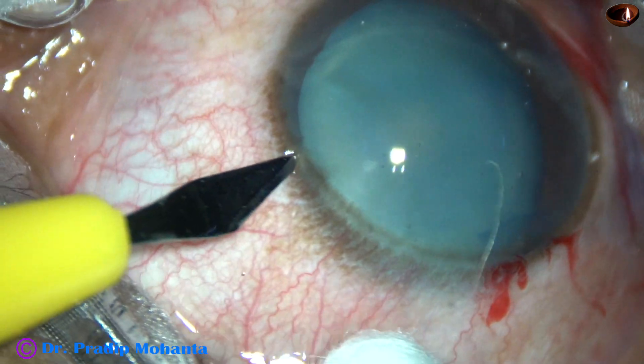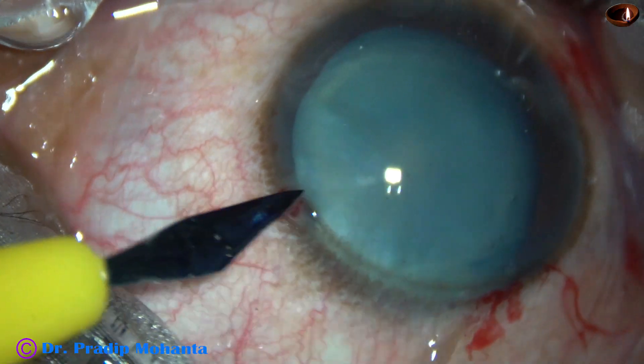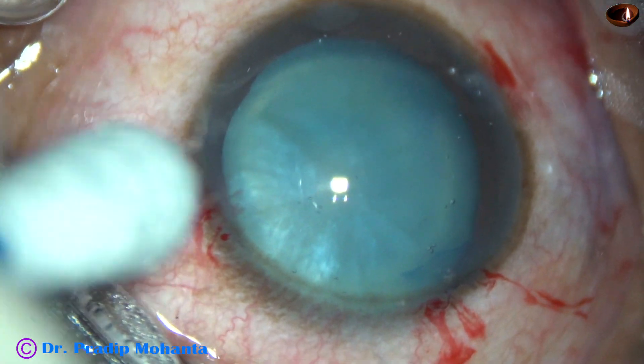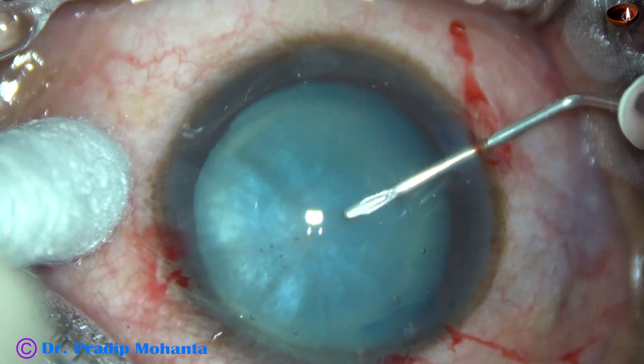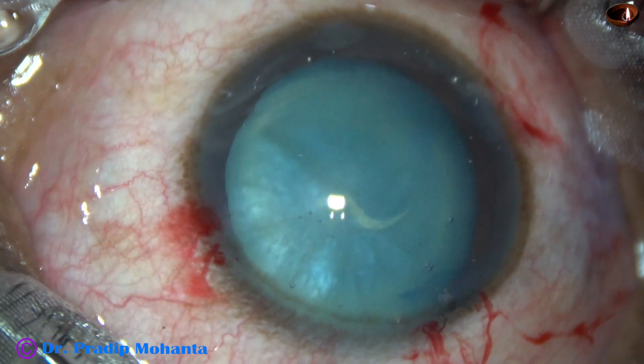A side port is made on the left side of the main incision. And now is the time for capsulorhexis. A bent needle — 26-gauge bent needle — is used to get a flap.